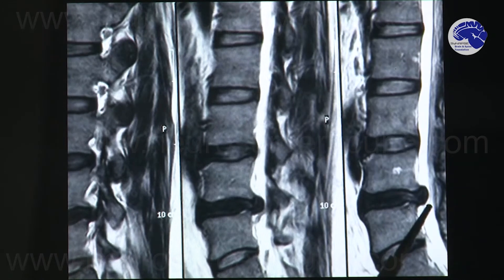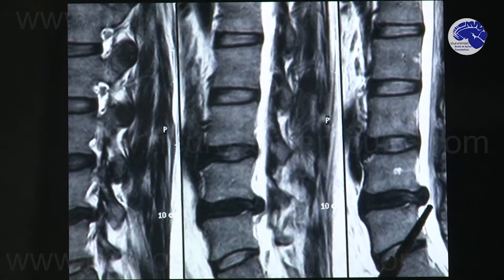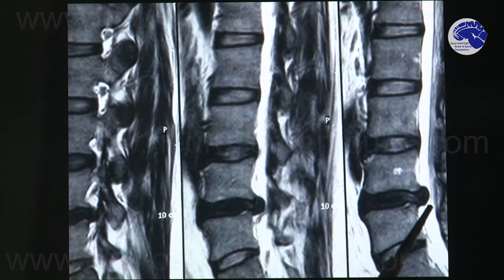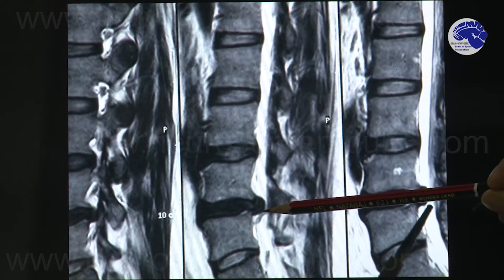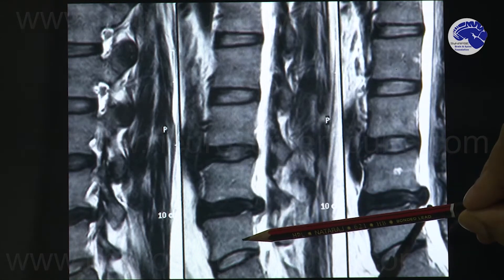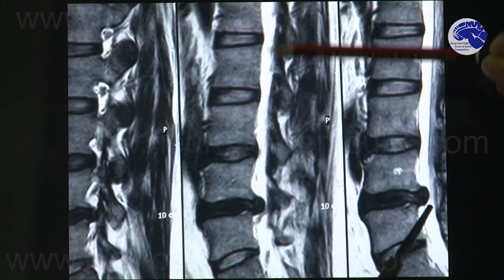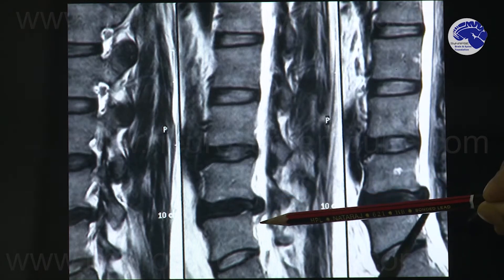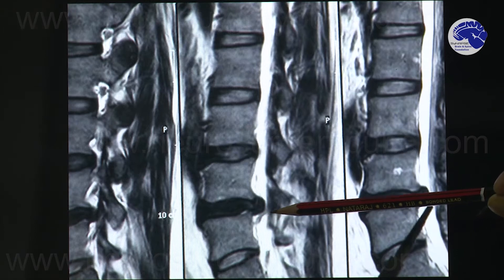This is a case of a young patient who came to our spine center with complaints of severe right-sided sciatica. He complained of severe pain starting from his low back and going into his right thigh, right calf, and right foot, and it was becoming unbearable for him to lead a normal life. On his MRI you can see a prolapsed disc at the level of L4 and L5, in the lumbar or low back region, and a thread-like nerve getting severely compressed by this herniated portion.